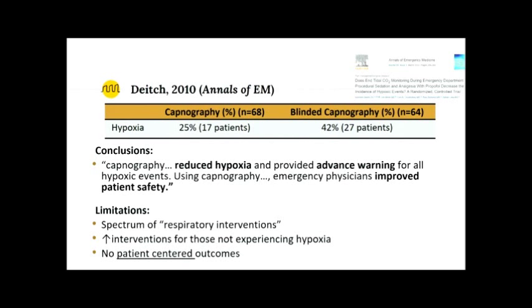And importantly, there were no patient-centered outcomes here. So does having an O2 saturation of 92%, 91% have any sort of physiologic impact? That wasn't necessarily commented on. And I think it's important to understand these limitations. But this really formed the basis of Dr. Bancourt?